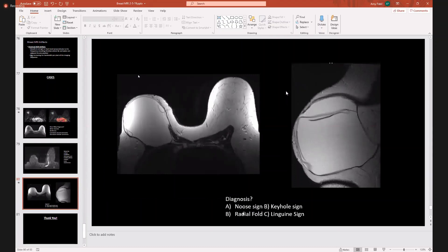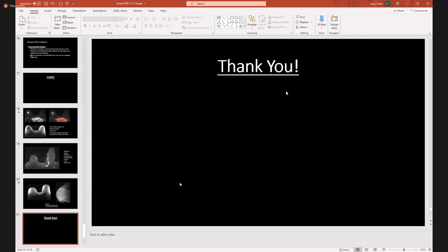Finally, this case is looking for silicone implant integrity. We see wavy lines in this right silicone implant consistent with the linguine sign, consistent with an intracapsular silicone implant rupture.